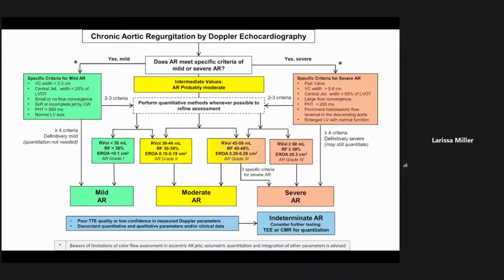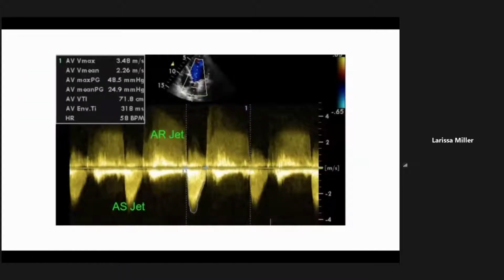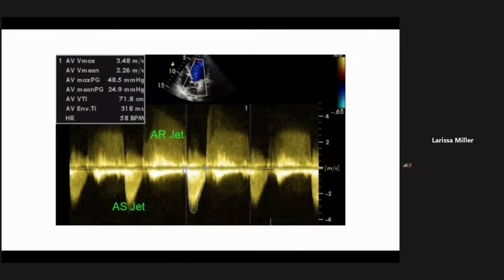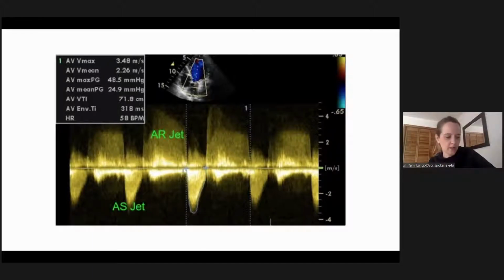And Tammy, sorry. That last picture was a good example of when we were talking about having stenosis and regurgitant in the same one, right? When you were talking about there's not going to be that space. No, because this isn't showing any MR. Can you guys see? Can I stop sharing? Let me just get through this and I'll show everybody what she was just talking about with that IVRT, the AS, and the MR, like I showed you in that drawing on the blackboard the other day.